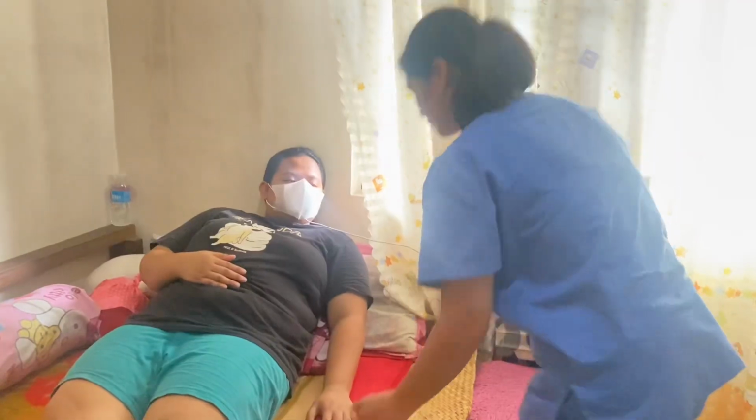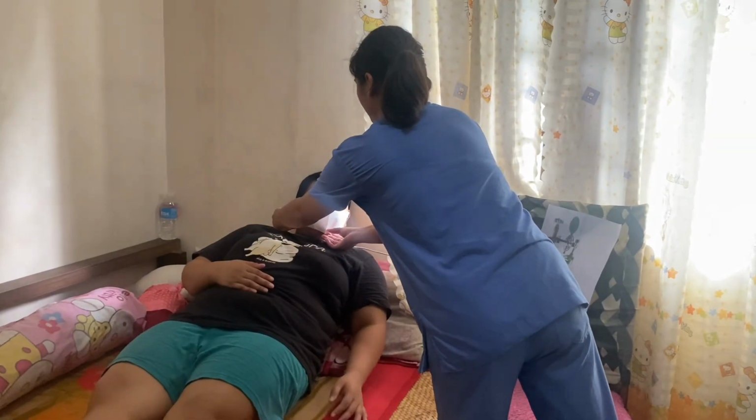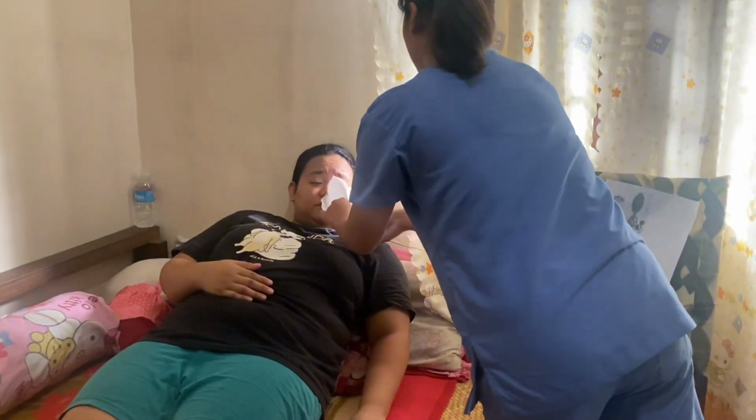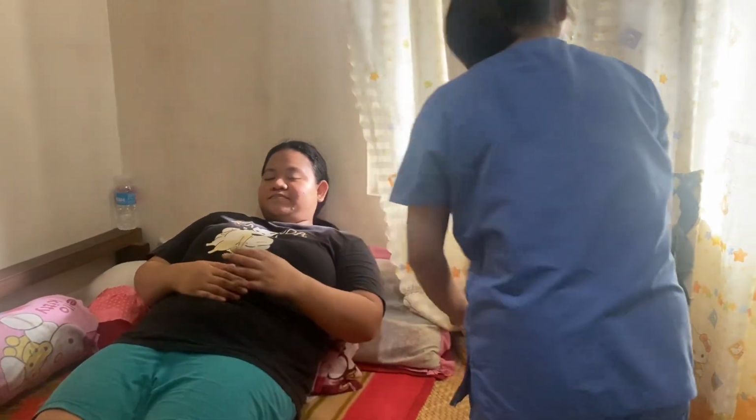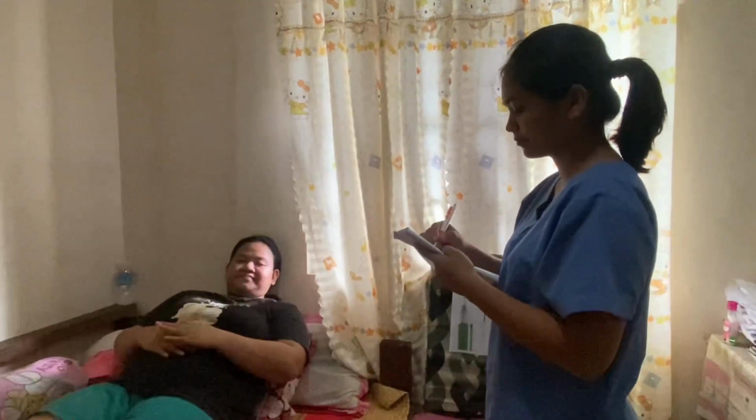Sige. After client verbalizes indication for supplementary oxygen, monitor for unexpected outcomes and perform related intervention. After that, record and report intervention in patient responses.